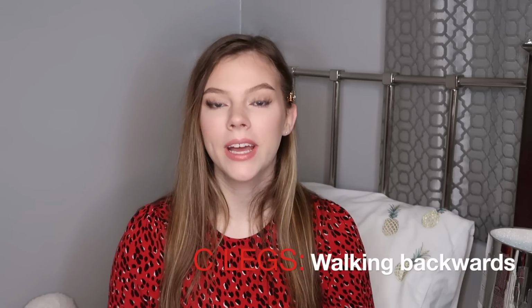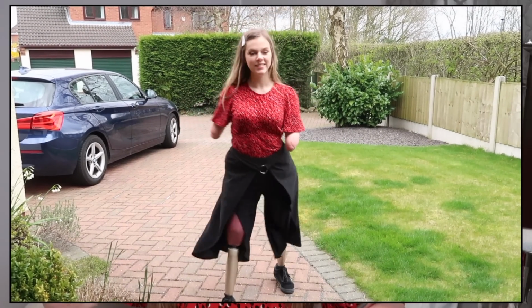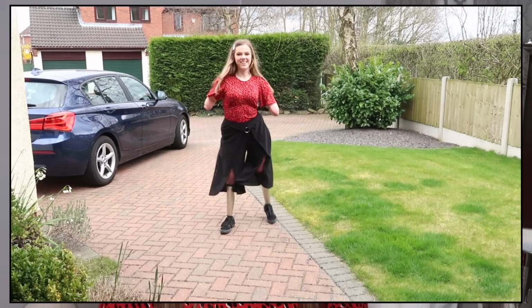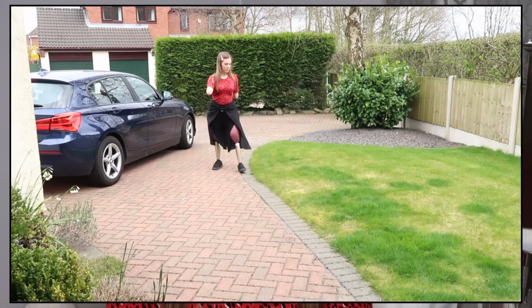The next one is walking backwards. Now I think because of the bend in the knee, I found massively that walking backwards is a lot easier for me. So I guess it's the same sort of principle, but because you have a little bit of bend in the knee now, which I never had before, the knees just bend, allowing me to do the full backwards motion walking. I'd say this isn't like a normal walk, like a normal person, but it's a lot better and more improved than it was on my blades, so I'll show you that in the clips as well.